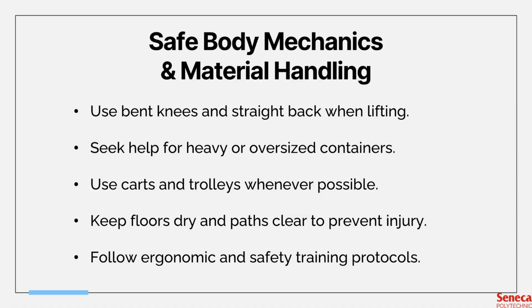For this reason, actually, a lot of the time, environmental services, so those are the cleaners, are only allowed access in the MDRD when there's low foot traffic. So that would be during the night shift, for example. I recall several times it would be 10 p.m. So I would be working 3 to 11 p.m. By 10 p.m., it's already calmed down a bit in the department, and that's when the environmental services usually comes in to clean up our department. That's when they would use wet mops, for example.